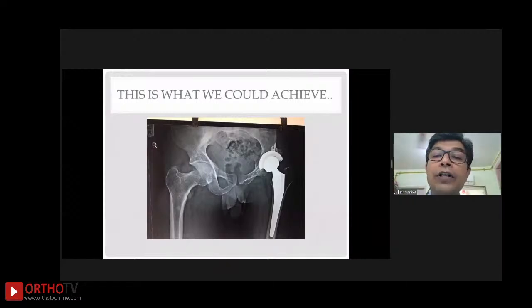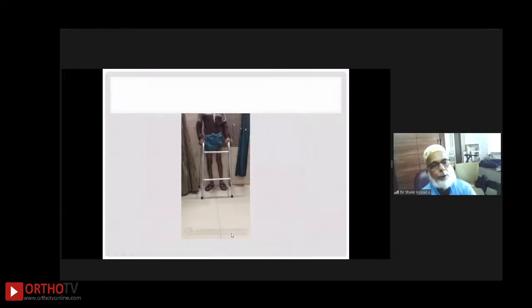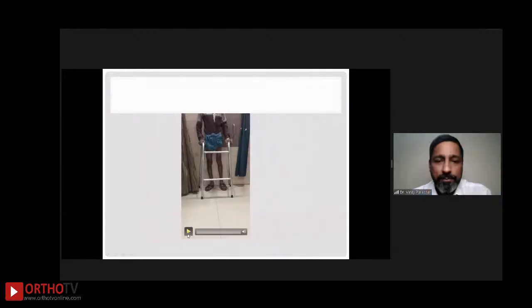Vinay, somebody from the audience is asking about the bearing that you have used. Yeah, it's a ceramic head. Okay, ceramic on highly cross-linked polyethylene. Can you show us the gait, your video? This is the post-op immediately.